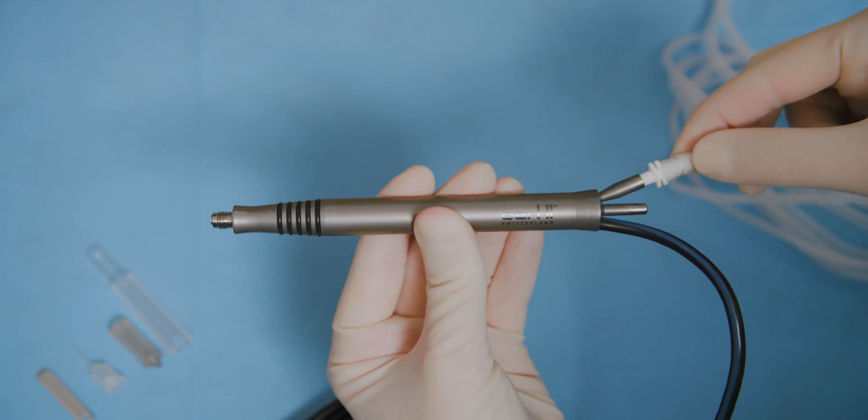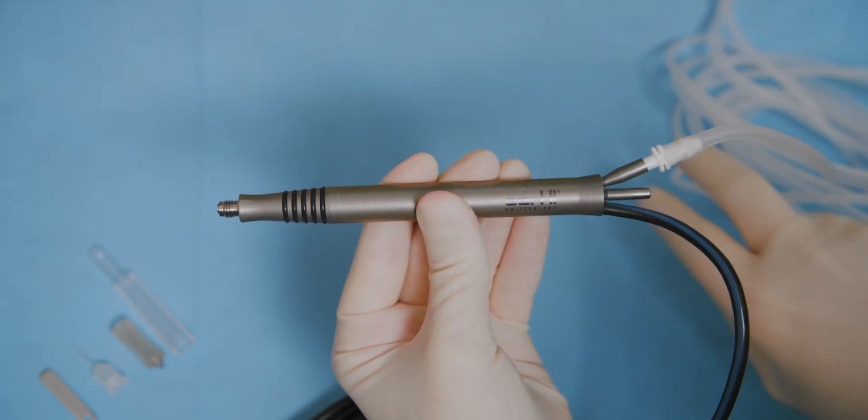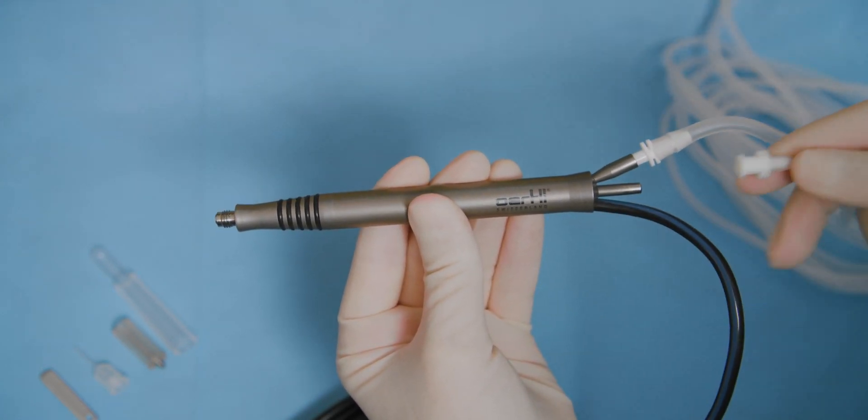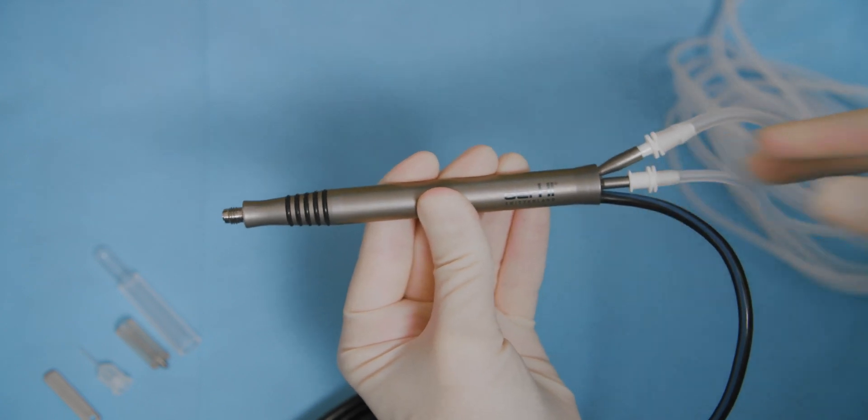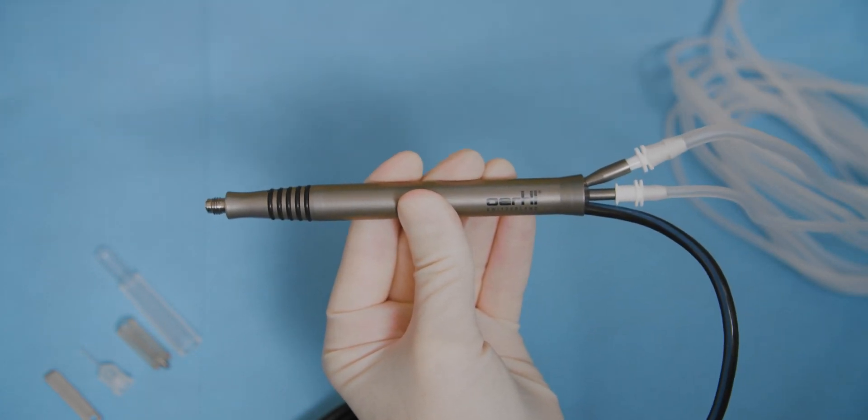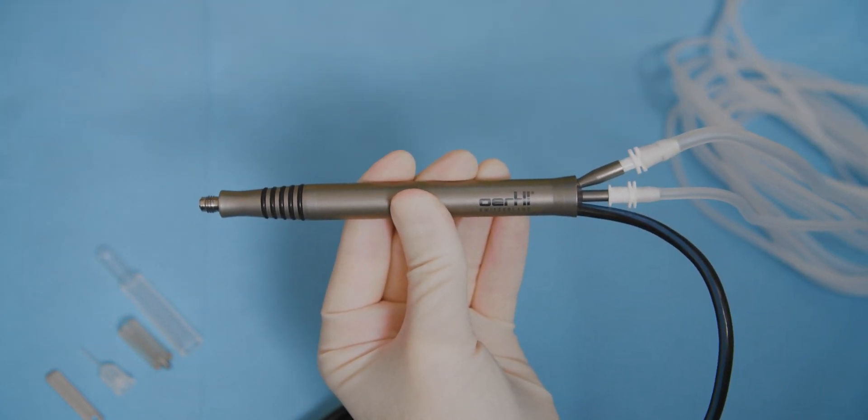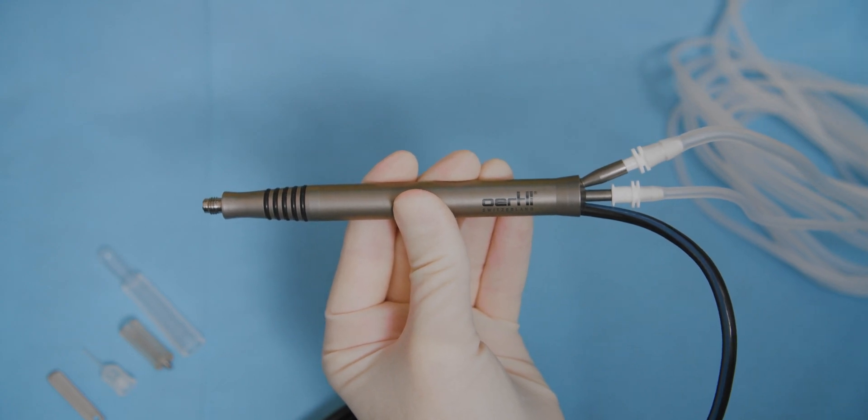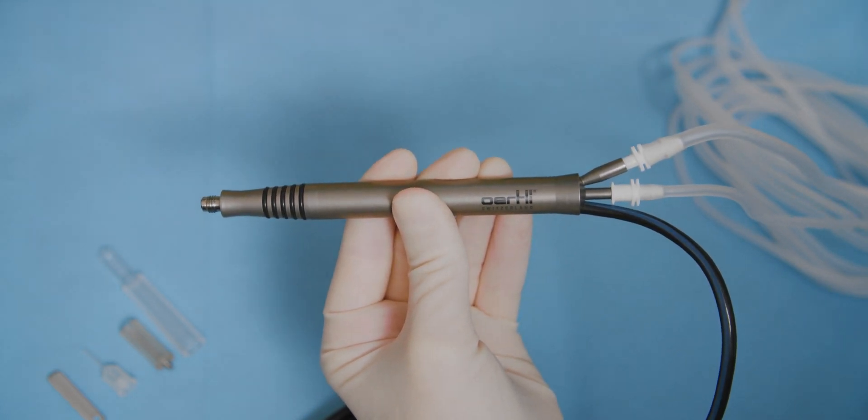Insert the irrigation tube and the aspiration tube into the ultrasound FACO handpiece. The lure connectors are designed to make incorrect connection of the instruments impossible. Make sure the connections are firmly secured.